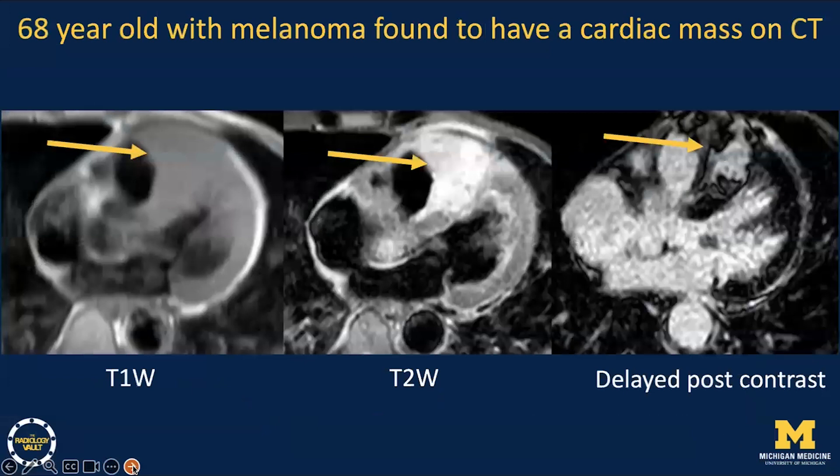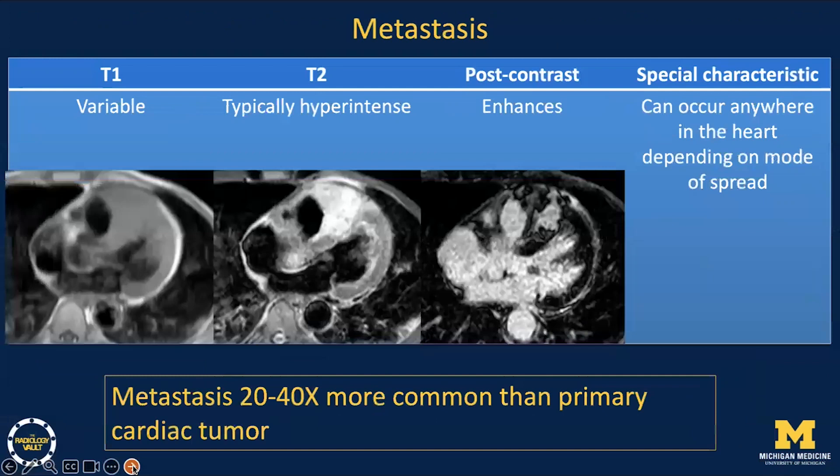Our next case is a 68-year-old with history of melanoma found to have a cardiac mass on CT. The best diagnosis in this case is metastasis. Metastasis can have variable signal on T1-weighted sequences, but are typically hyperintense on T2-weighted sequences. Metastases enhance and can occur anywhere in the heart depending on their mode of spread. Remember, metastases are 20 to 40 times more common than primary cardiac tumors, so in patients with history of underlying malignancy, a metastasis should be a primary diagnostic consideration.